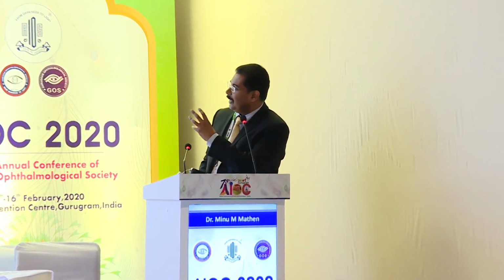And I was surprised to see in the first two videos that your bottle height is above 100. Do you always go for that? Because when you have these kinds of very low settings, this will be okay. But I am more worried about surge than having a higher bottle height. So what is your message? Should it be above 100 or below? But you should not get surge. If I get surge at 90, I will bring it up to 100. Thank you so much.